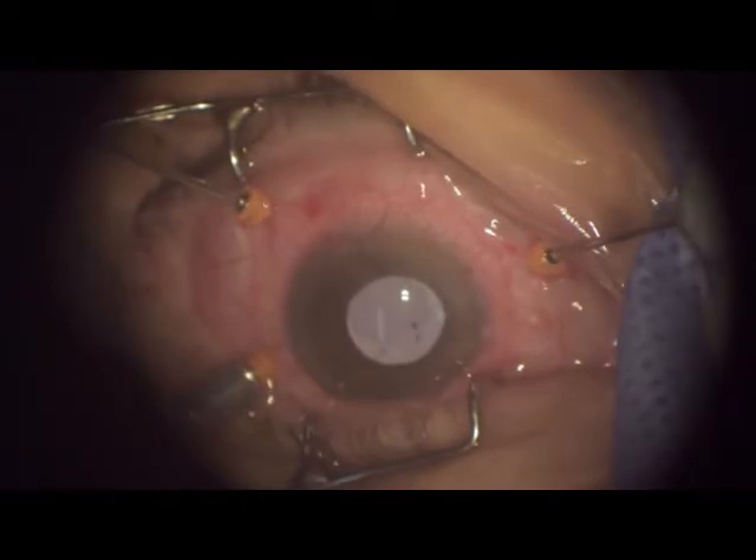There is some leaking but it stops and fades very fast. We keep moving the retina in all directions, trying to get rid of the RPE cells as you see. This is an inverted retinotomy — you see the instruments up, and now you see them down. We put the retina back to its original position and now we are able to insert the PFO. After inserting the PFO, the retina attaches but moves upwards.